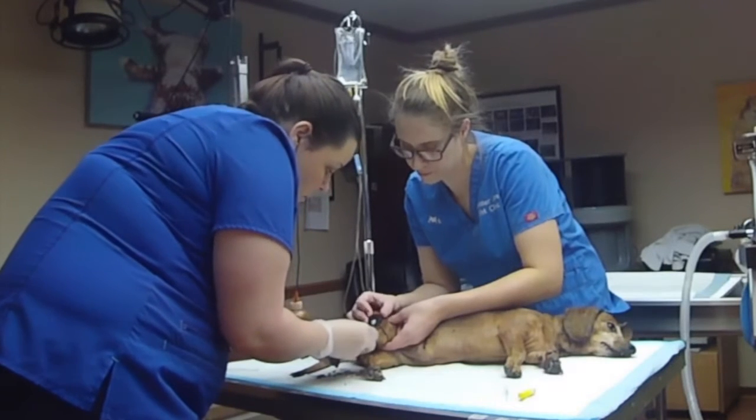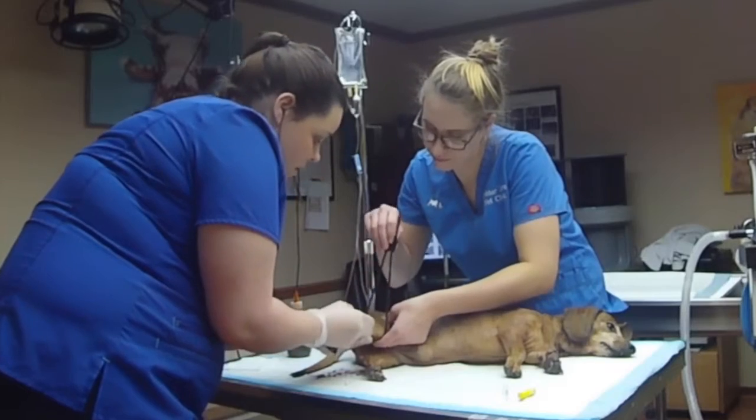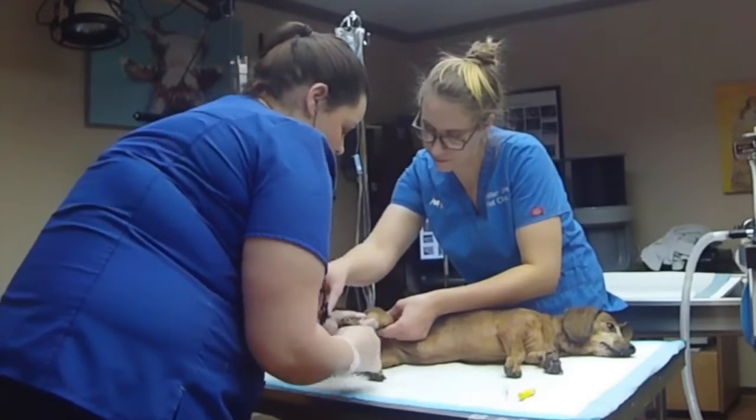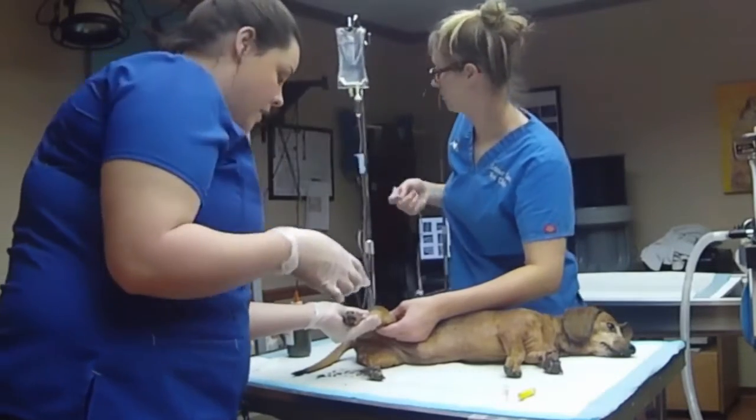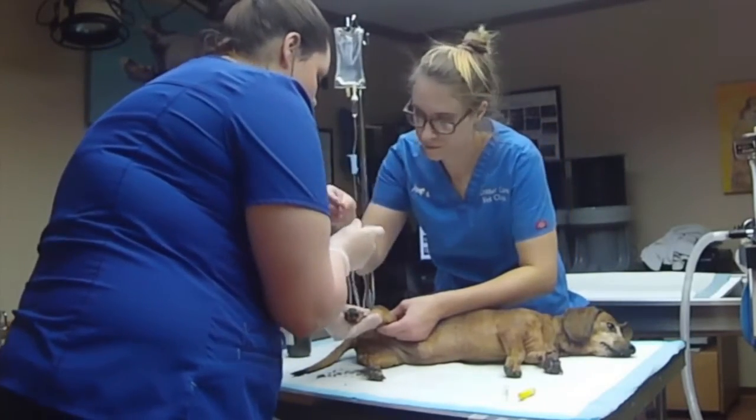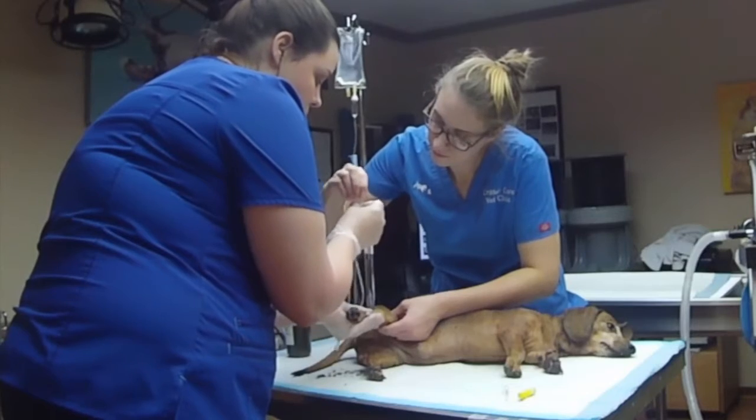Okay. So once her preceptor lets off the tourniquet, then I will pull out once we get the IV fluid started. She's actually getting a dental done today. She has some really, really bad teeth.